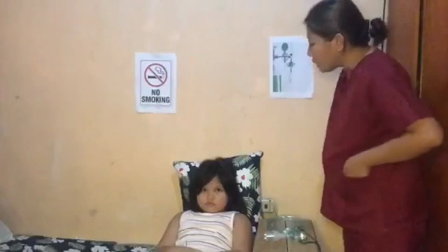It is important because it can maintain adequate tissue oxygenation while minimizing cardiopulmonary work, and also deliver oxygen to people who don't get enough oxygen. And lastly, it is for people with respiratory disorders. So, shall we start, Miss Anika Faye?